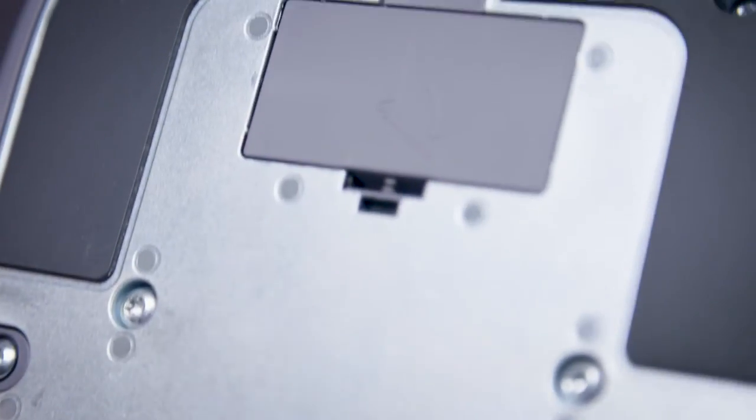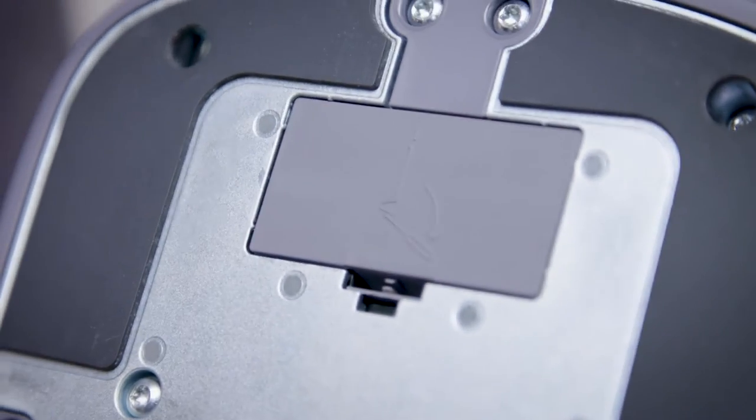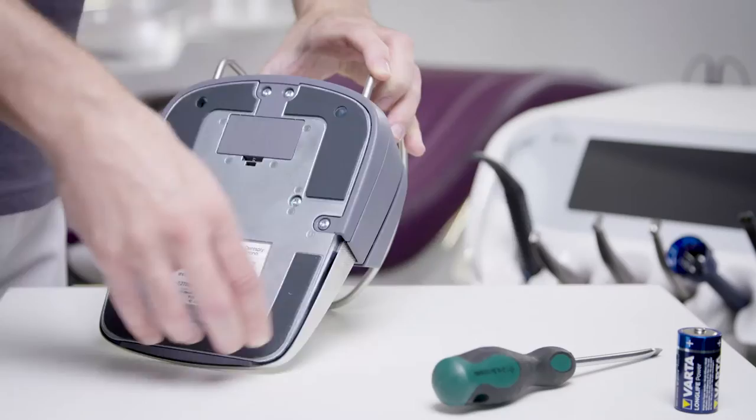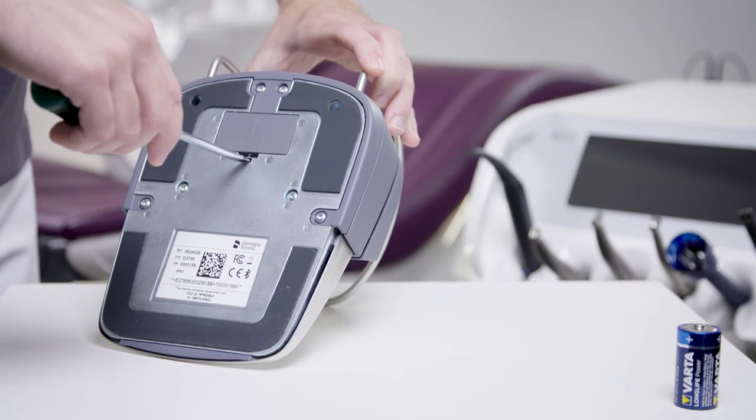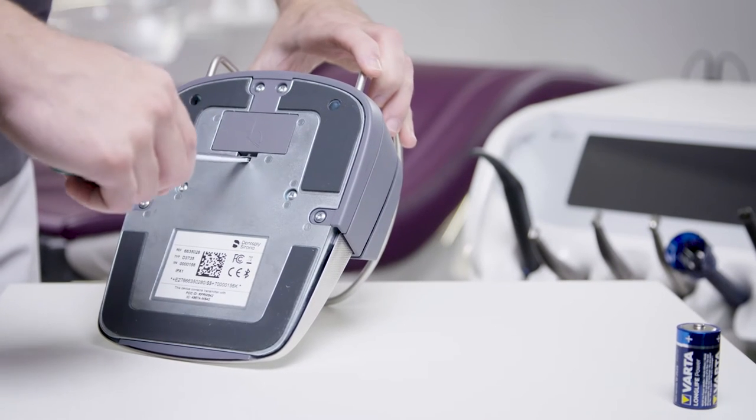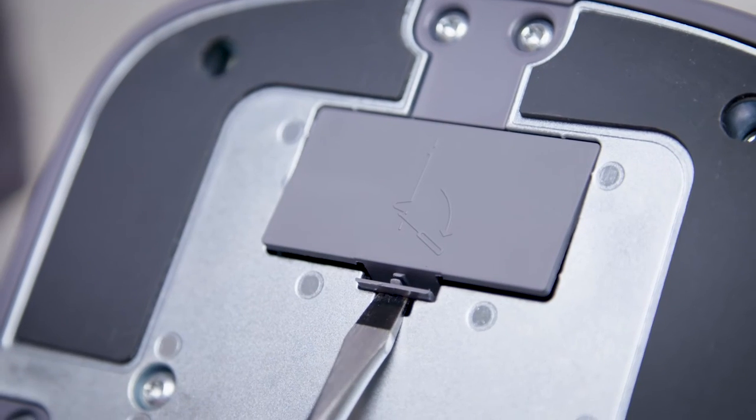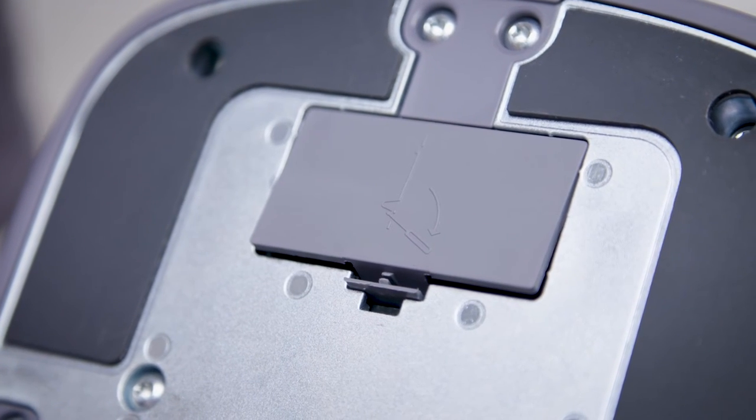The battery compartment is on the bottom of the smart control. Open the battery cover using a screwdriver, for example.